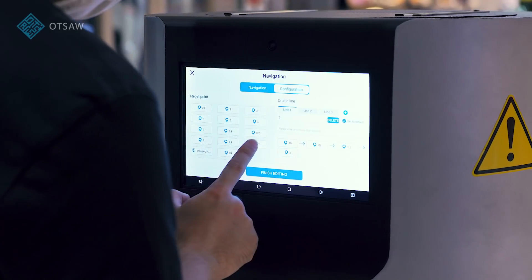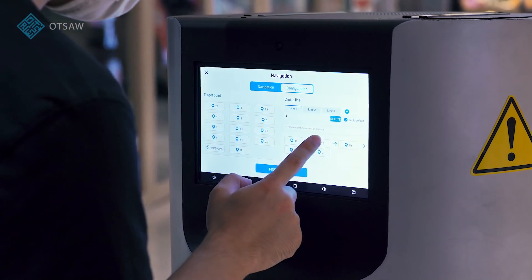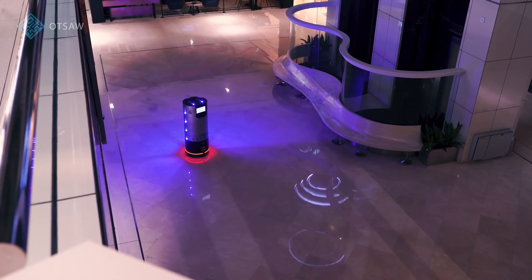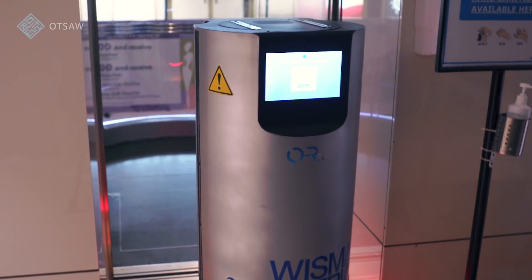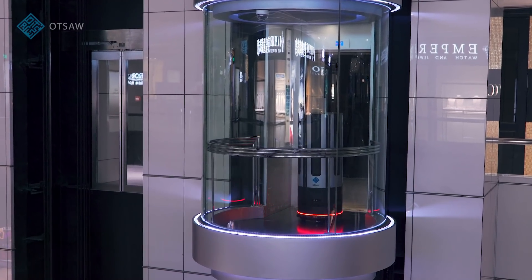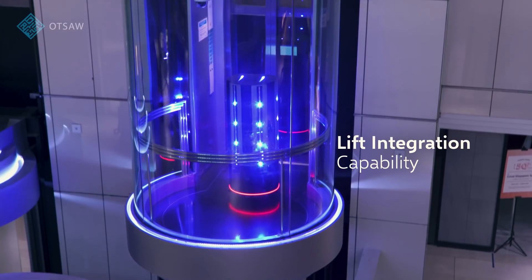The ORX user-friendly touchscreen makes it easy to operate. It can also be operated by voice command or be managed remotely with OTSA's fleet management software. Lift integration capability means the ORX can autonomously travel between multiple floors for complete disinfection coverage.